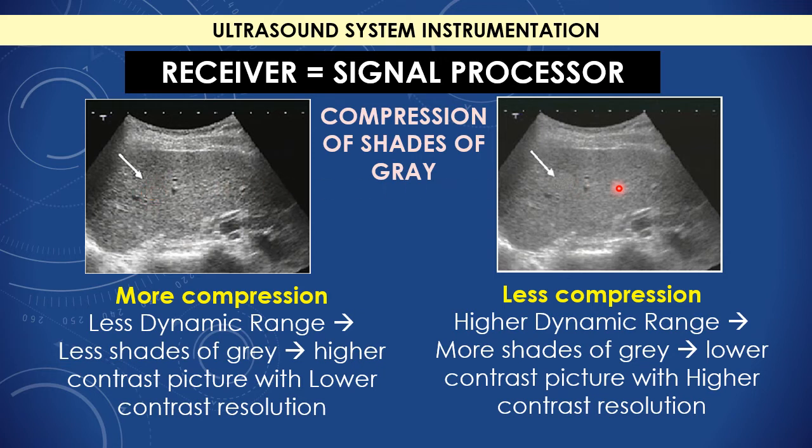Now we go to the next one here. This next one is where we apply less compression. When you apply less compression, what happens? The image gets a little smoother, right? Because I'm having more shades of gray that are available now to document or to give each point its exact shade of gray. So what happens now?